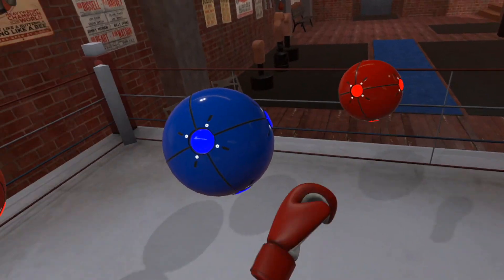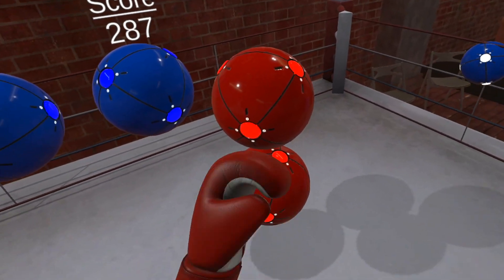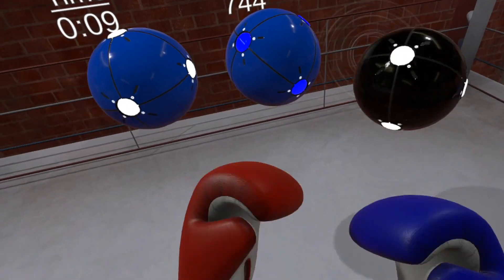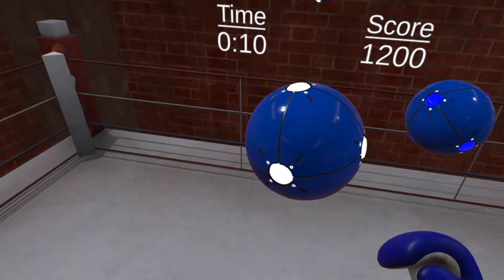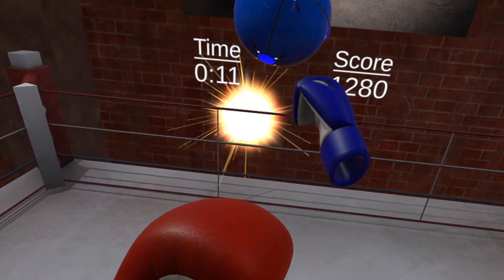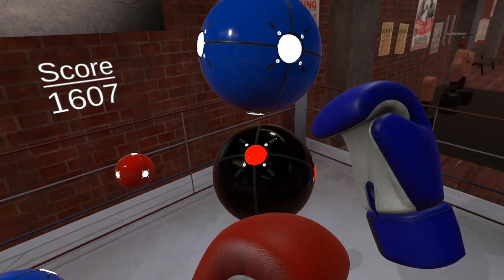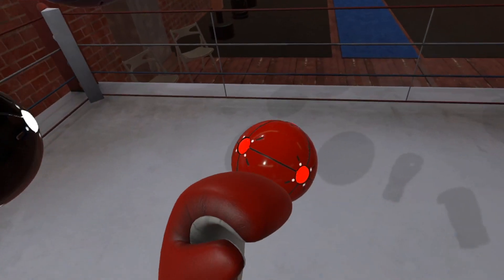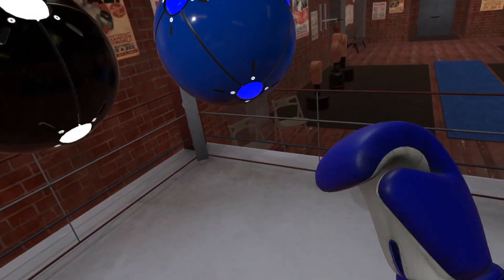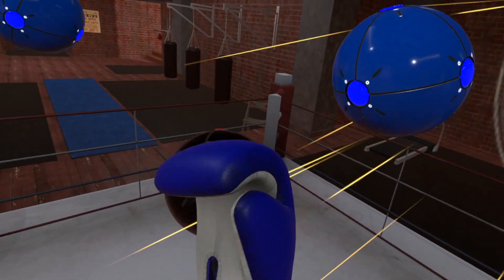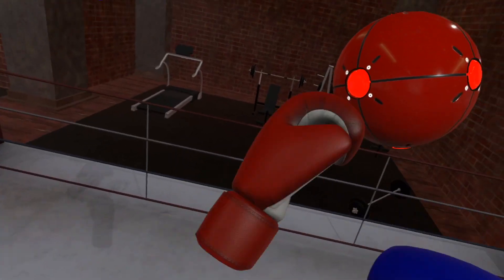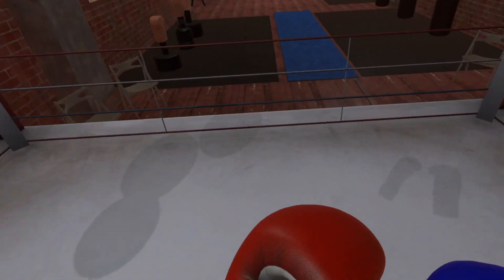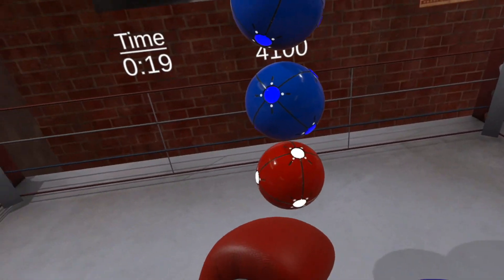The customization parameters in this activity include Spawn Radius and Target Lifespan. The Easy, Medium and Hard settings decrease the amount of time each target is shown.